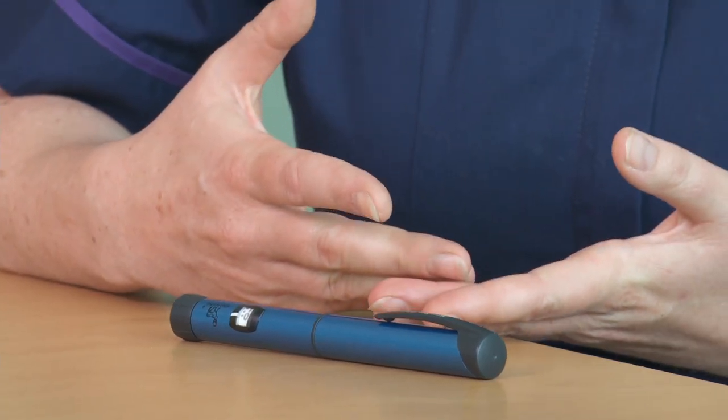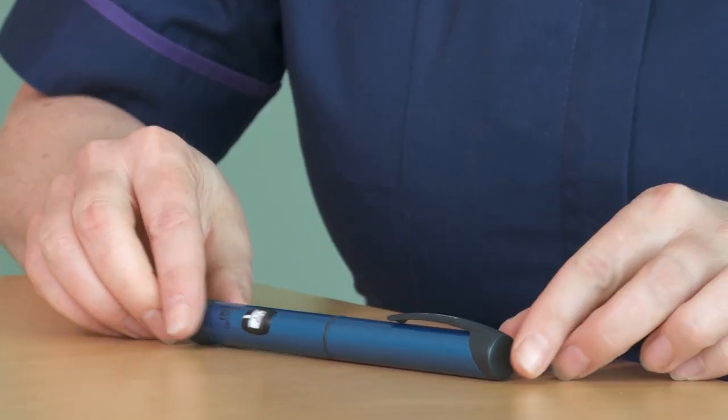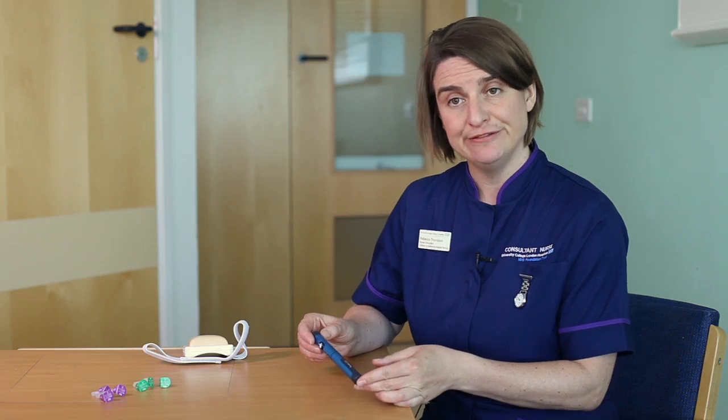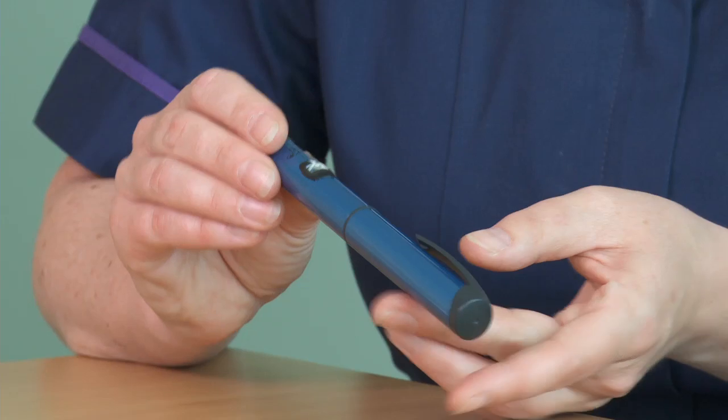I'm going to show you how to use an insulin pen. There are different insulin pens to fit different insulins. This pen is a Novo Pen Echo and it fits Novo insulins — so Novorapid and Levemir insulins.